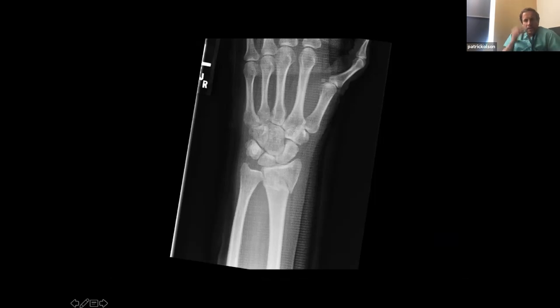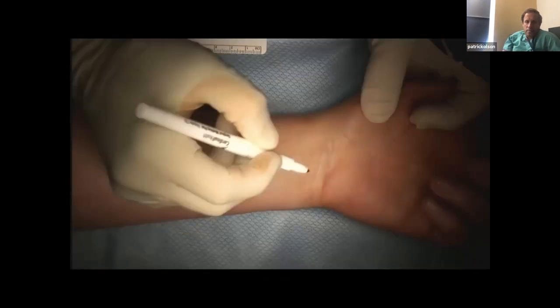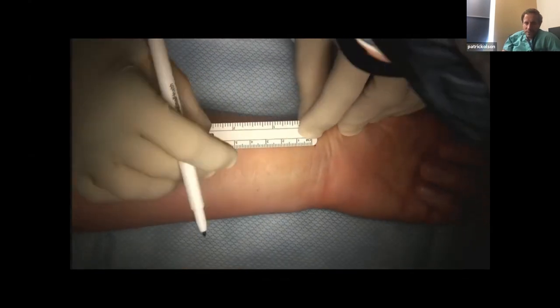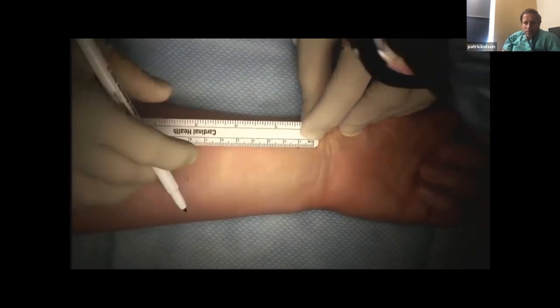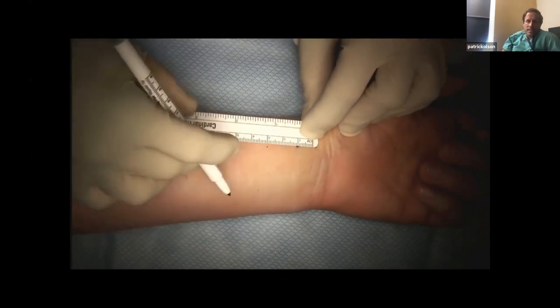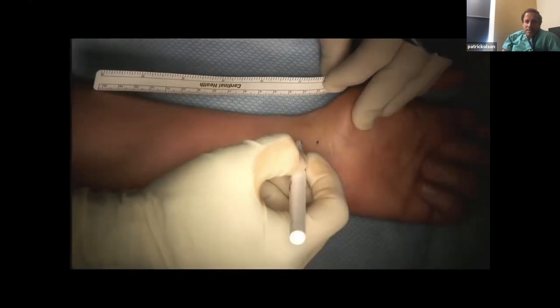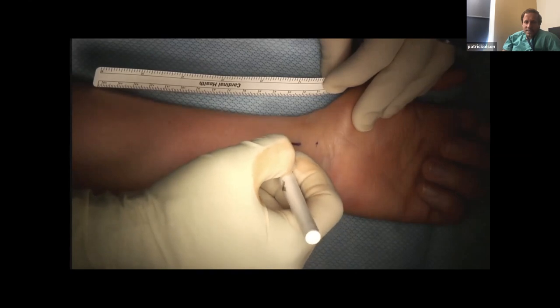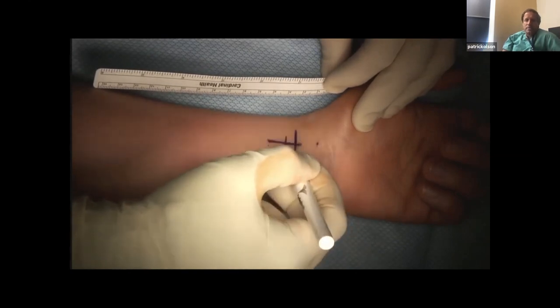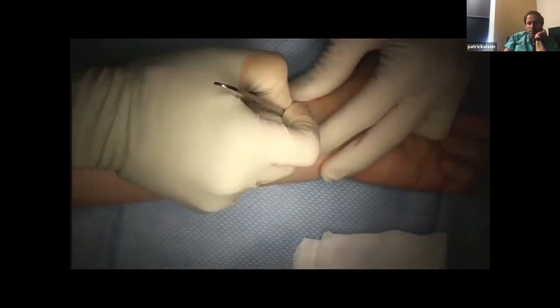So let's show how to do this — it's pretty straightforward as mentioned. The key is your starting point. Here's the most proximal wrist crease, there's the distal wrist crease and the proximal wrist crease, and then you go one centimeter proximal to that proximal wrist crease. Then just measure two centimeters — you can go a centimeter and a half, whatever you want. That is really the key to doing this through a small incision.